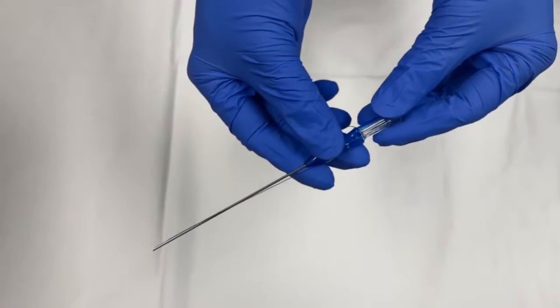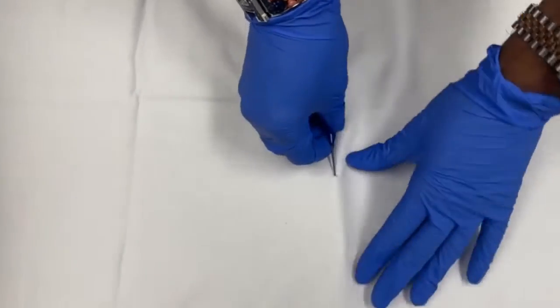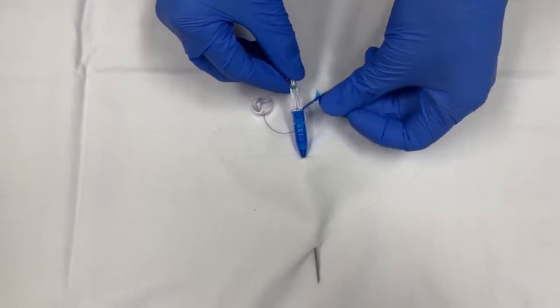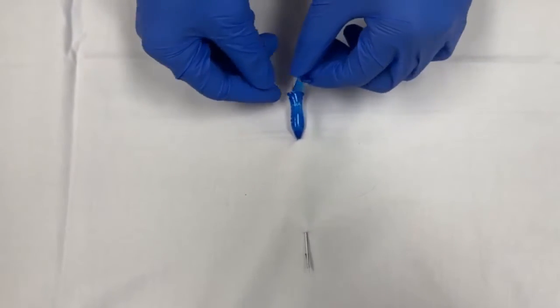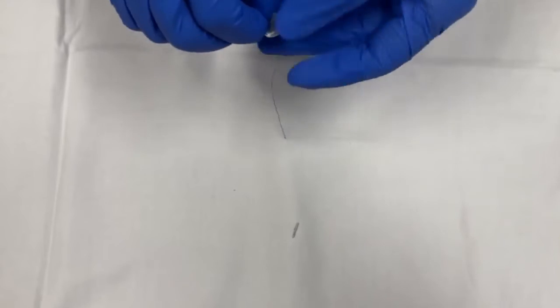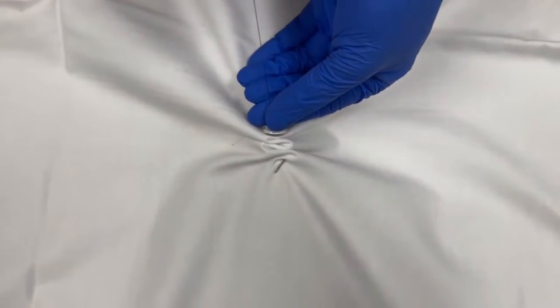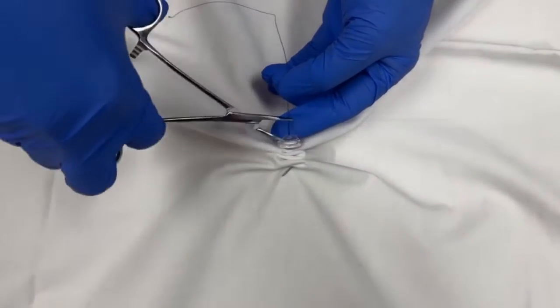Now we'll show how the T-fasteners work. For illustration, we are approximating the sheets tightly together. However, in real life, we should not approximate them so tight so that it does not cause pain and tissue necrosis. This is how T-fasteners approximate the stomach wall to the anterior abdominal wall.